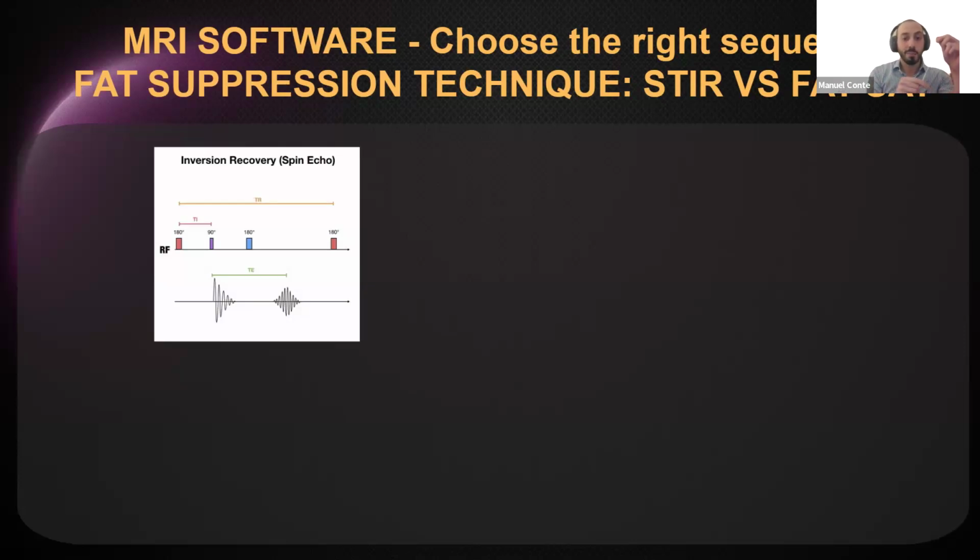So we wait a certain amount of time, called TI, until the tissue we want to suppress is at zero, and then we start with the 90-degree RF pulse. In the STIR, short tau inversion recovery, normally the inversion time at 1.5 Tesla is 150 milliseconds. Because of the Larmor frequency equation, if you use 3 Tesla, the TI is higher. It's around 230, I guess.